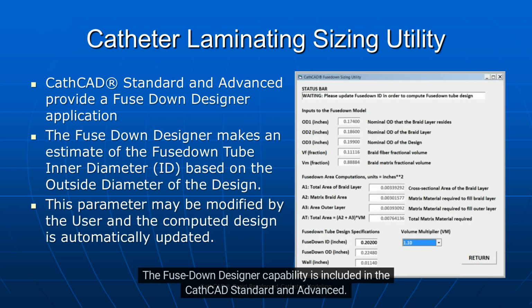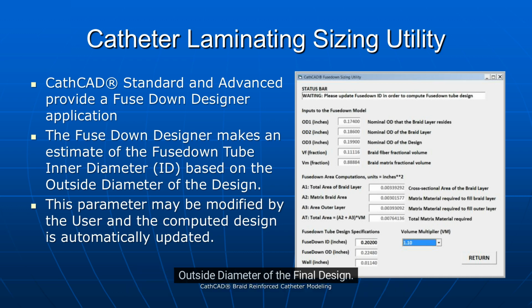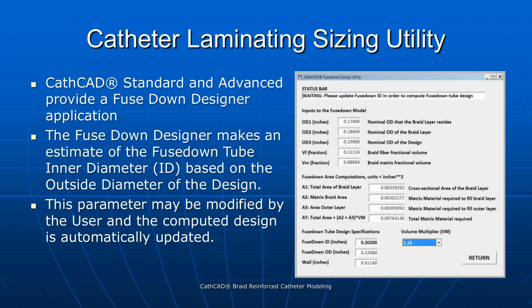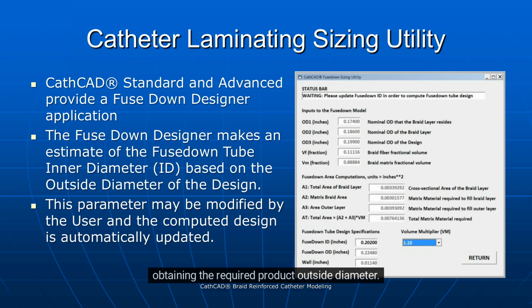The fuse-down designer capability is included in the CathCAD Standard and Advanced. The fuse-down designer makes an initial estimate of the fuse-down tube inner diameter based on the required outside diameter of the final design. This fuse-down inner diameter may be modified by the user, and the computed design is automatically updated. The output from this module is the fuse-down tube inner and outer diameter that results in the catheter design obtaining the required product outside diameter.